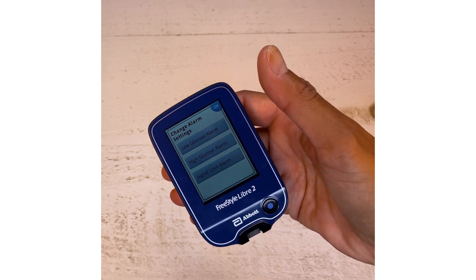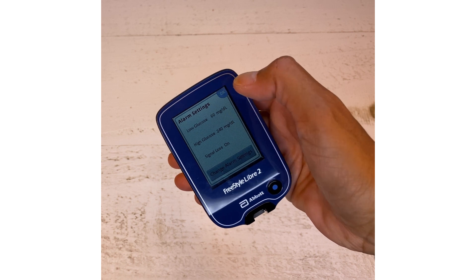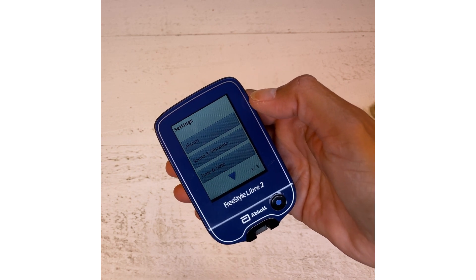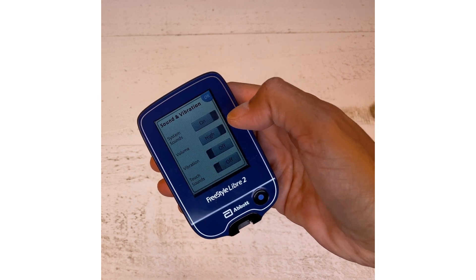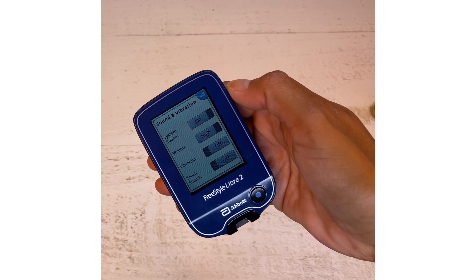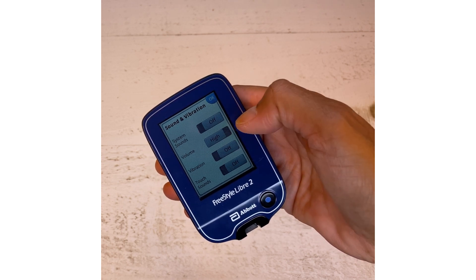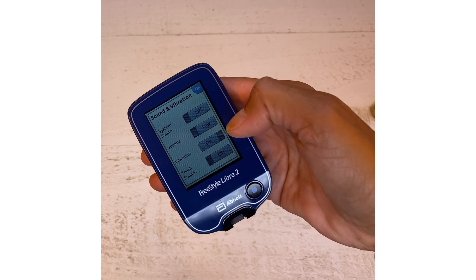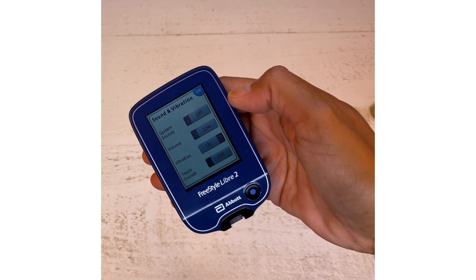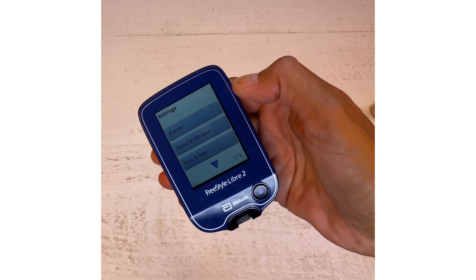Once you're done changing settings to whatever you want, click OK in the upper left corner. Next, look at Sound and Vibration — that's how you want to be alerted when something is off. Right now sound is on, but you can take it off and just use vibration. So now it'll only vibrate when you have alerts — I kind of like this setting, so that's what I'm going to go with.